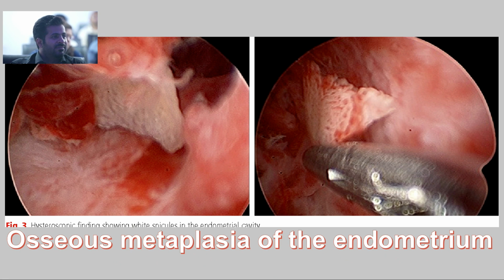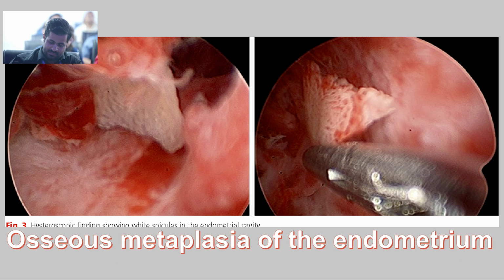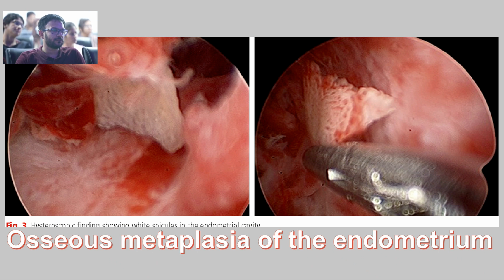This is osseous metaplasia. It looks like a fetal bone. I told you, if this type of fetal bone like thing is visible, be careful to give any report. Send for histopathology, let the histopathologist decide.